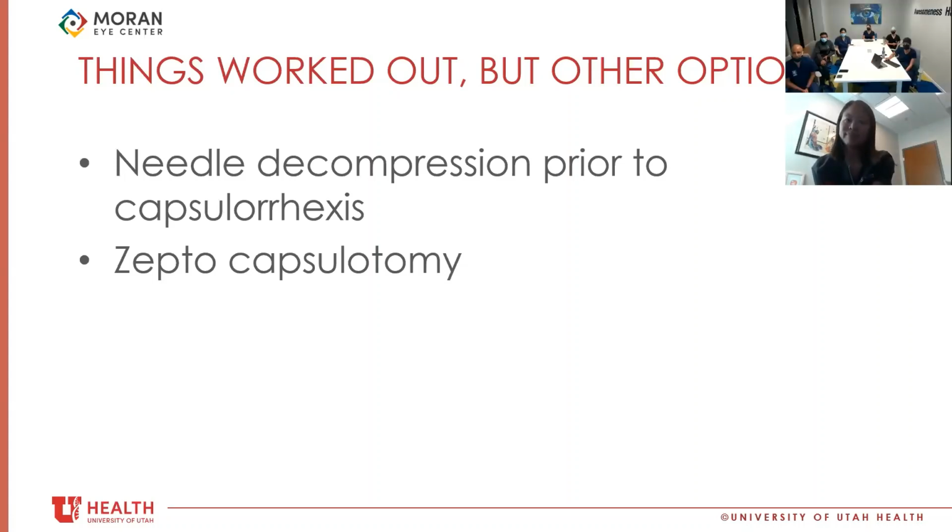Yes, it is faster. I've used it on a couple of patients. We're relatively new with Catalyst here, but on a couple of patients it seemed to have gone okay. But it's amazing that you're able to take the lens out without extending that radial tear. Yeah, clearly. That's really amazing.